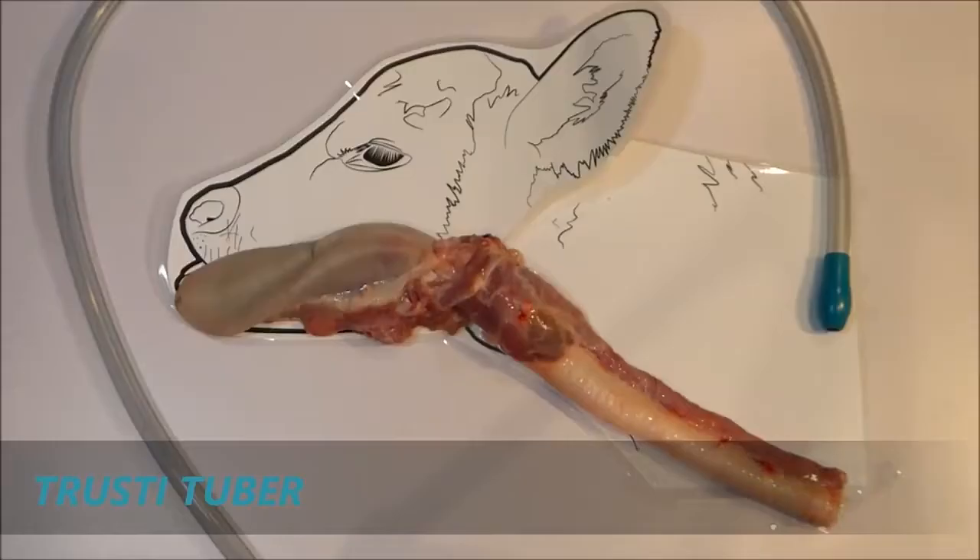Today we are showing the esophagus, trachea and throat and explaining what you need to know about this anatomy to ensure safe tube feeding.